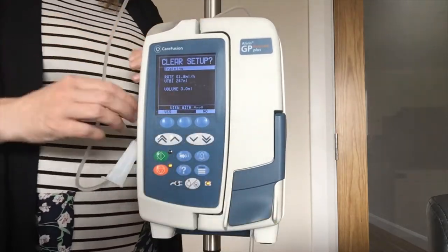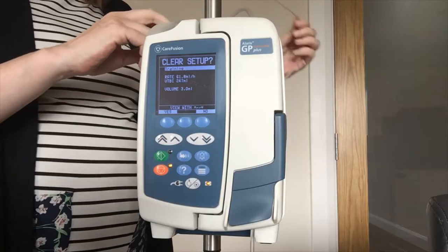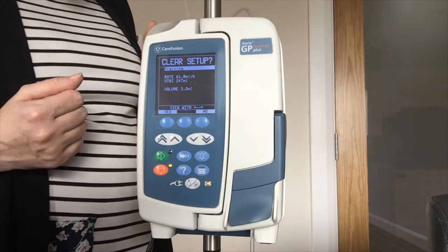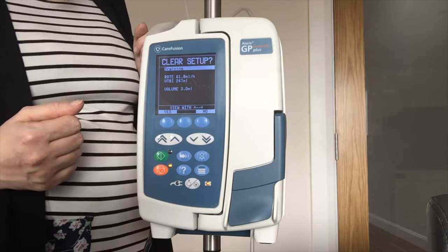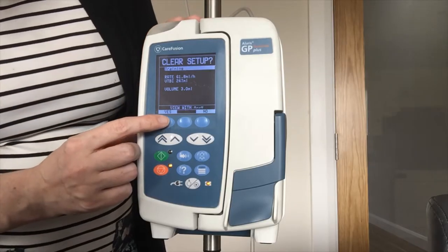Always open your roller clamp before you attach the line to the patient, just to make sure that there is no free flow and that the pump is doing its job. The pump is quite intuitive if you follow what is happening on screen. At the moment it is asking me to clear the setup, so if it is a new patient I will always say yes to get rid of the last patient's history.